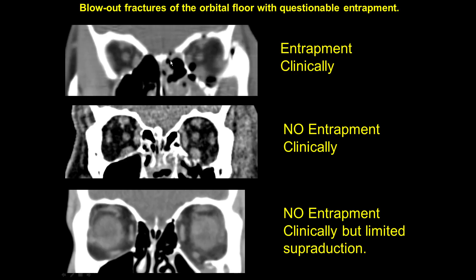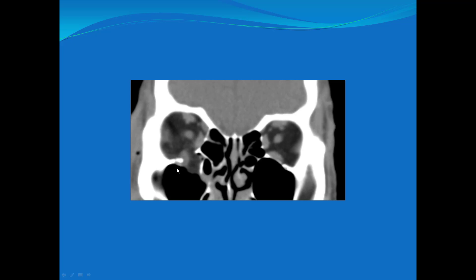Here are three examples where the extraocular muscle, the inferior rectus, looks abnormal — it has a rounded appearance instead of the normal horizontal appearance. One was entrapped, one was not entrapped, and one was not entrapped but had limited superduction. By CT, it's really hard to tell if there's entrapment, and usually there is no entrapment. Ophthalmologists note that radiologists often suggest entrapment, but in adults in particular, it's rarely present. In children with trapdoor-type fractures — where bone breaks and snaps back — it's much more common. Even in one case where the muscle was wrapped around the fractured orbital floor, there was no entrapment.